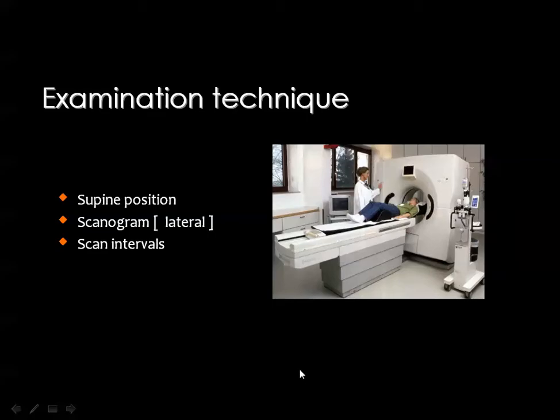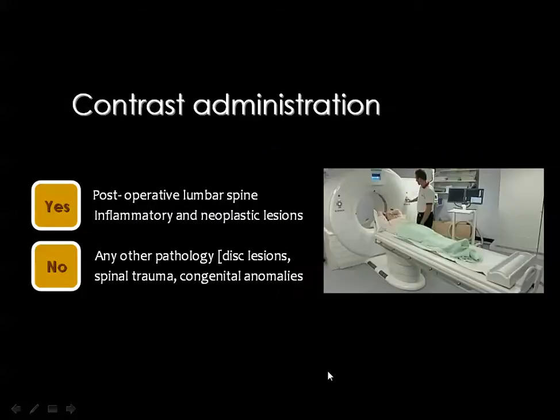You know that the degenerative diseases of the spine are also known as spondylosis or spondylodegenerative diseases that can be evaluated by the plain X-ray, the CT scan, and the MRI. And I have explained in the part of the normal anatomy how to perform the CT scan of the spine, and also I have mentioned the needs for contrast injection.